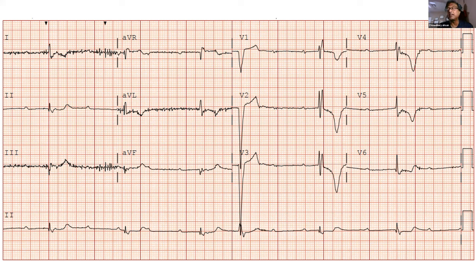And this is the reason I showed that this is at 4:30 in the afternoon on a Friday. Question is, will you stop the beta blocker and watch, or will you put the temporary wire? You have to push the temporary wire. This is a very unreliable rhythm. So just stopping the beta blocker will not cut it. Rafiq bhai, you agree?